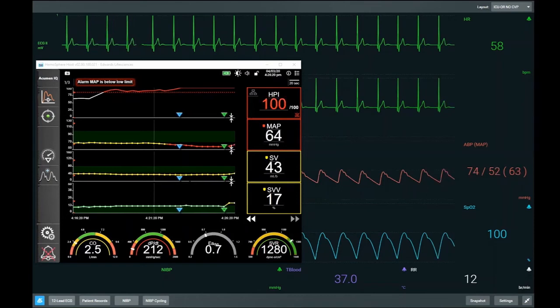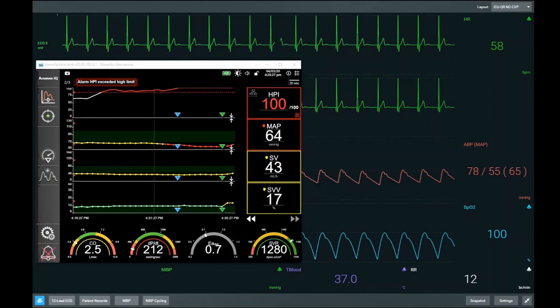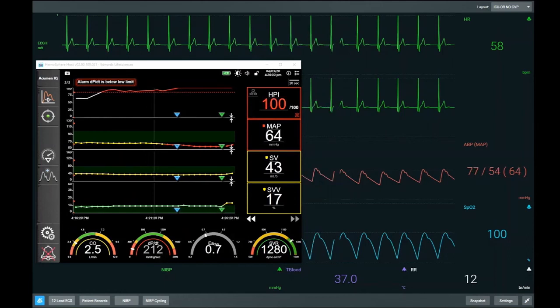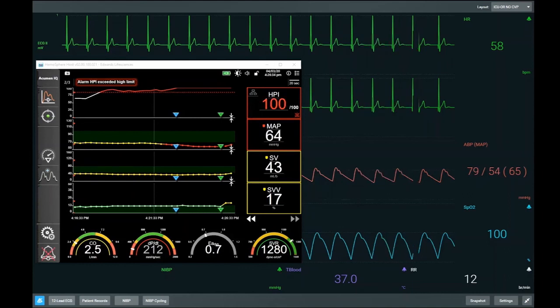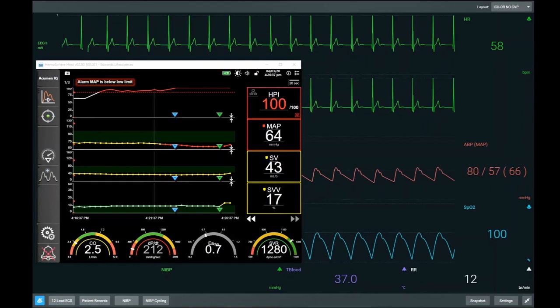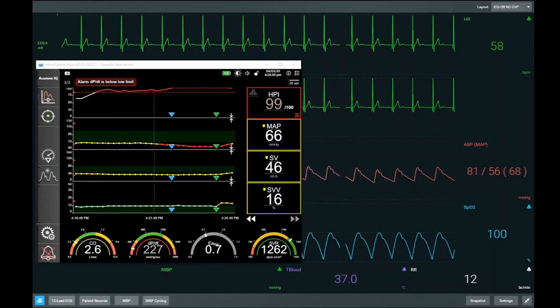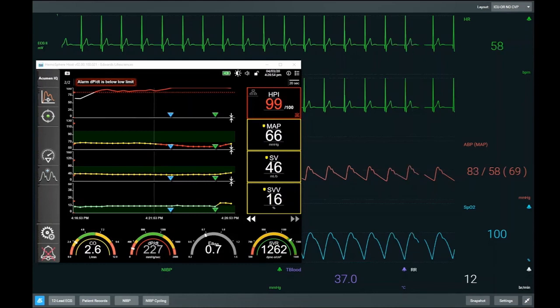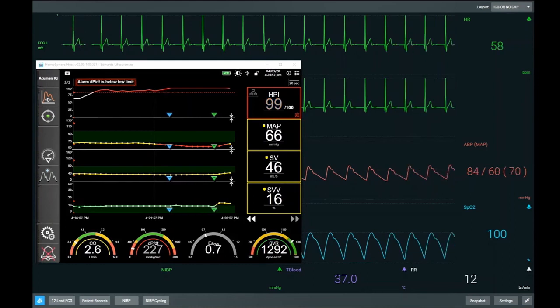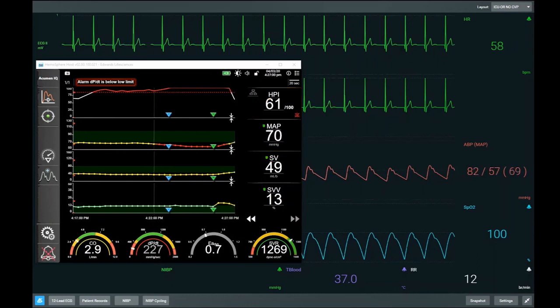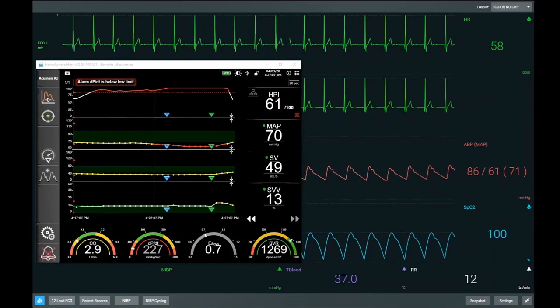And there we go — stroke volume has started to increase, gone from 37 up to 43. DPDT has also started to increase, now at 212. Giving that bolus of ephedrine — that beta stimulation and positive inotropy — has improved contractility, which has improved stroke volume and mean arterial pressure, and that increase in contractility is reflected by an increase in DPDT. Mean arterial pressure is now starting to increase — now at 66 — stroke volume continues to increase and we'll start to see HPI come down. By using HPI we can predict hypotension before it occurs — in this scenario we had at least four minutes' warning.